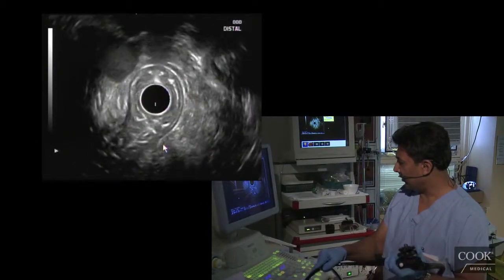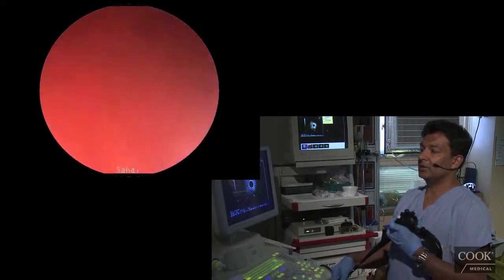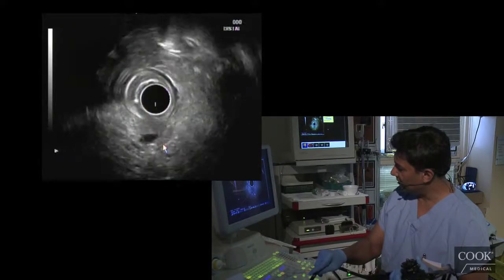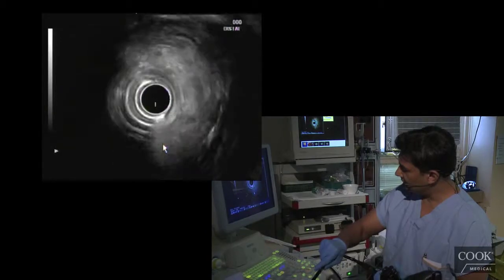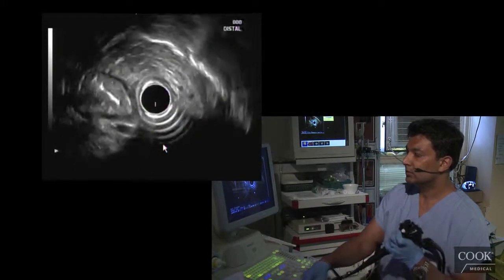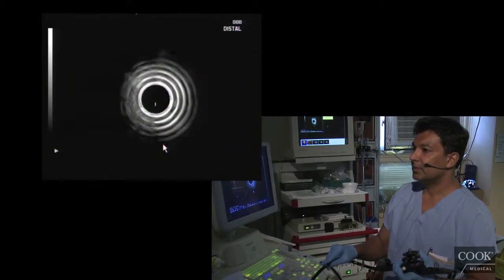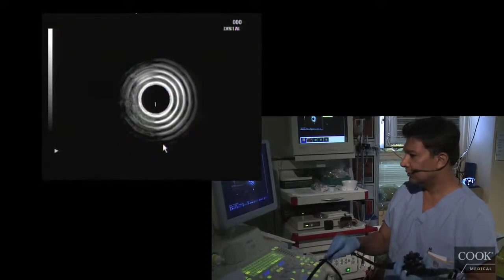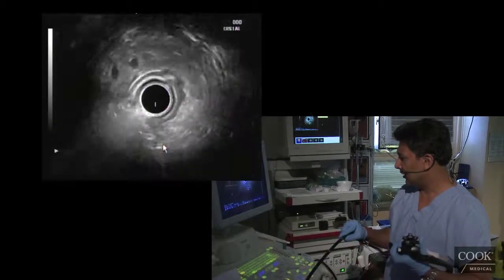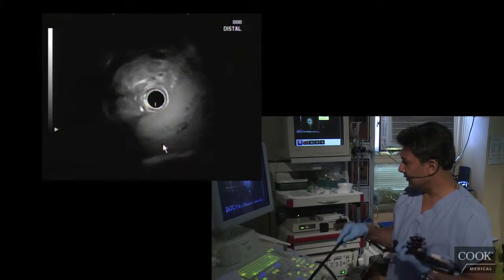Unfortunately, with this forward-viewing radial scanner, you can't look endoscopically at the papilla usually, which would be a nice part of this exam. But his bile duct is certainly clean. If he doesn't have any progressive cholestasis, I wouldn't worry about this too much. I'm not seeing his gallbladder — I think he's post-cholecystectomy; I read it in the chart. There's his liver down there — his liver looks pretty good as well. No intrahepatic dilation. Normal bile duct.